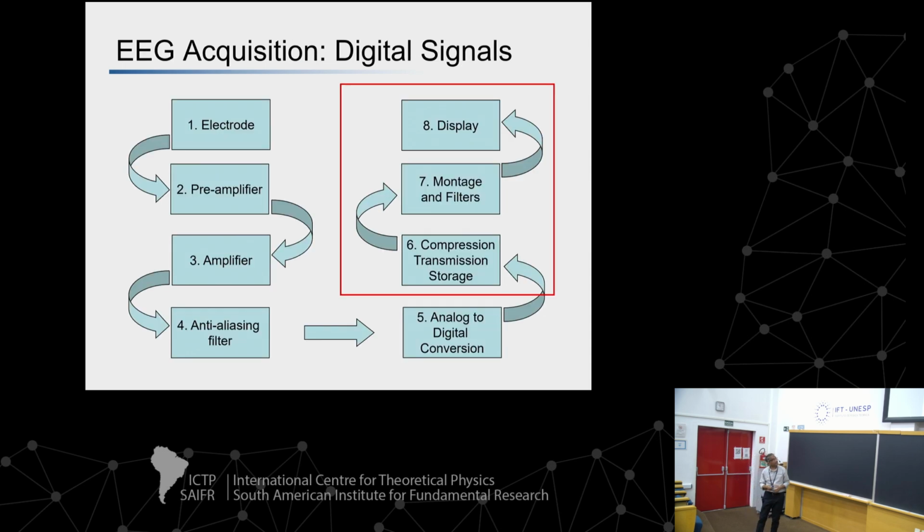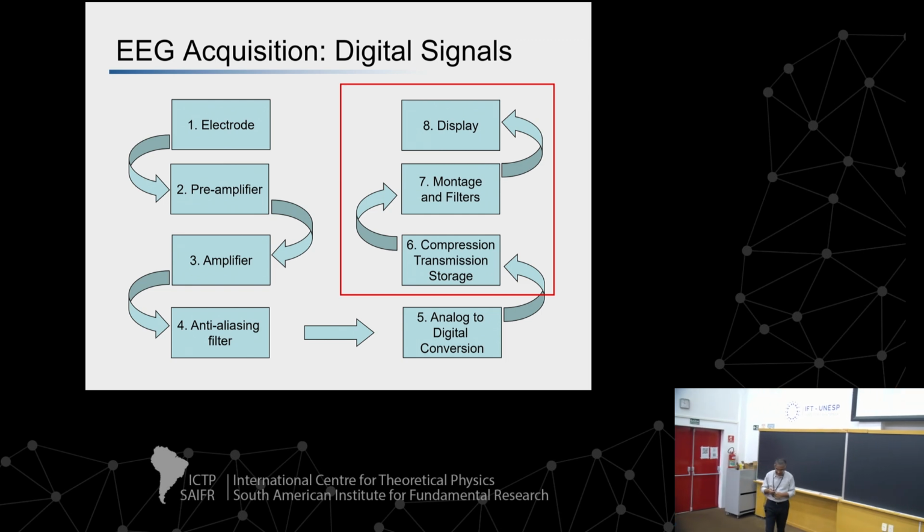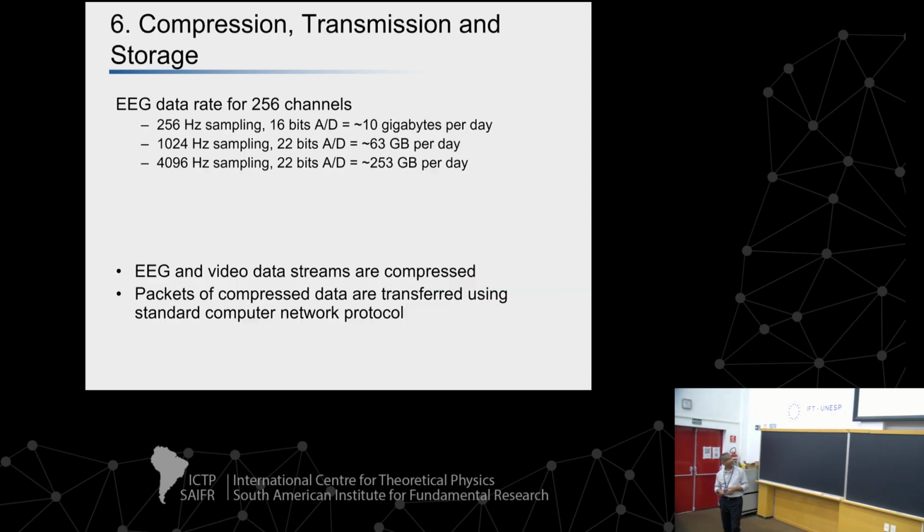all the channels. Now, as I mentioned, these parts, 6, 7, 8, are offline, and this is typically done in the epilepsy monitoring unit. The signals are out of the patient's room, and this allows us to then go in and flexibly change the filters in post-processing, change the way we display the signals, and analyze it in different ways. Some sort of thoughts about what we are doing.